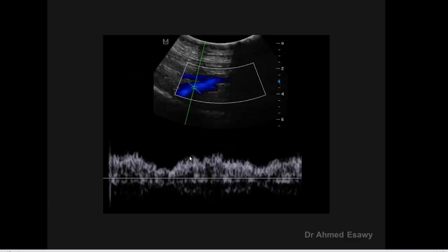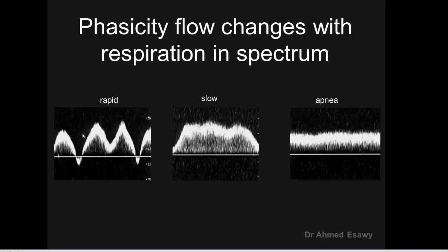This is an example of phasic venous flow. Flow increases in expiration and decreases in inspiration, represented by both spectrum and color. During expiration, the vein appears fully color-saturated, full with blood and flow. During inspiration, the color may be weak or absent. This is phasicity — flow change with respiration.